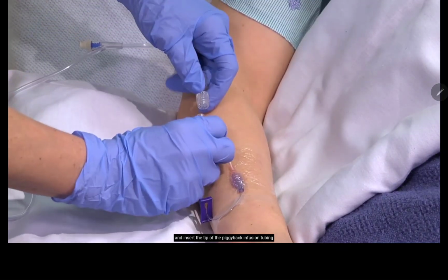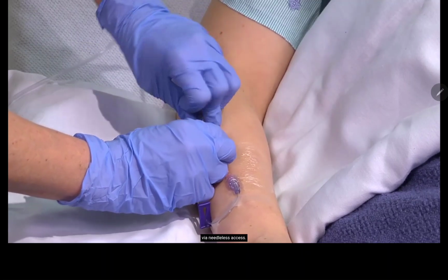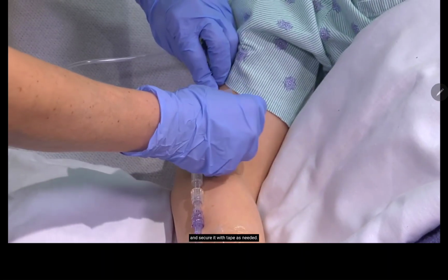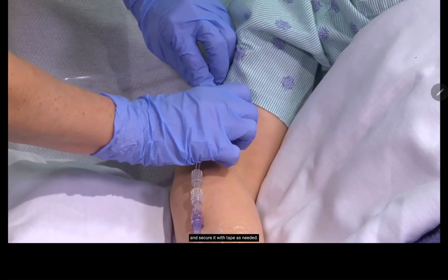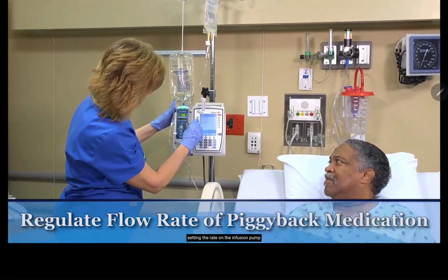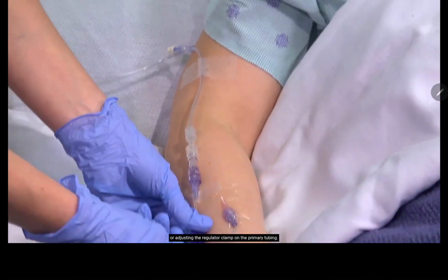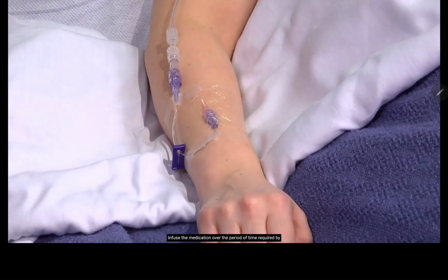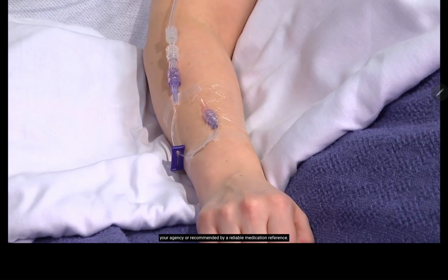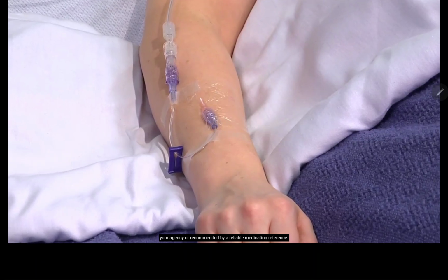And insert the tip of the piggyback infusion tubing via needleless access. Twist the luer lock fitting to secure the tubing and secure it with tape as needed. Now regulate the flow of the piggyback medication by setting the rate on the infusion pump or adjusting the regulator clamp on the primary tubing. Infuse the medication over the period of time required by your agency or recommended by a reliable medication reference.